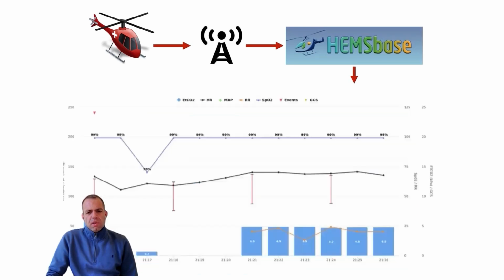It's also really important for subsequent data review. And what having good physiological data means is that you can very easily translate it into a graphic representation. So we'll come back to this, but you really want to be able to look at that whole pre-hospital phase and say, well, what did happen to my patient? What was their oxygen level? What was their blood pressure doing? And this dip, for example, is pretty significant.